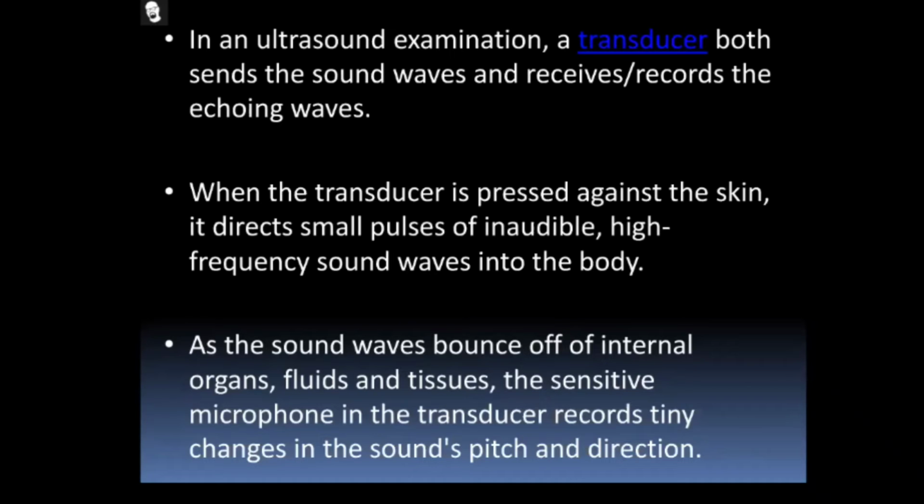As the sound waves bounce off internal organs, fluid and tissue, the sensitive microphone in the transducer records tiny changes in the sound's pitch and direction. That is a very important thing. The transducer plays a vital role from start to end, because it gives the input to the CPU for scanning the internal organs. According to the inputs from the transducer, the CPU shows the image and video on the monitor. If there is any obstruction, the monitor shows an abnormal video.